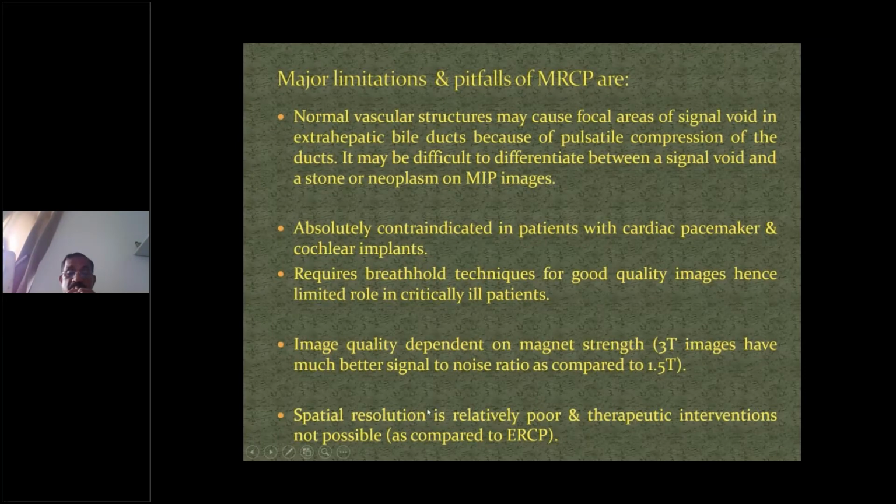And if we compare with ERCP, the main limitation is we cannot perform therapeutic interventions like we can do in ERCP. And the spatial resolution is relatively poor compared with ERCP, but that is slowly being overcome with advances in technology.